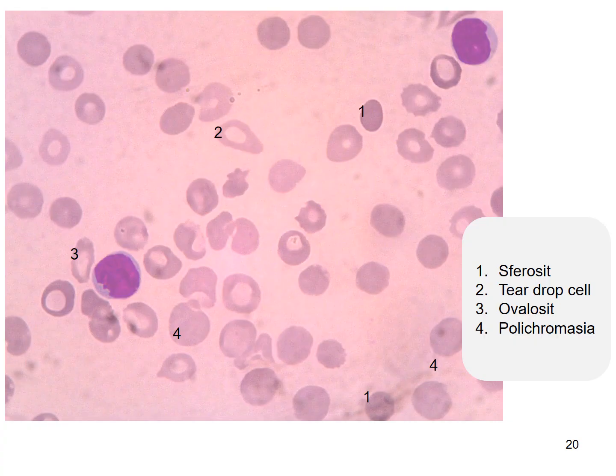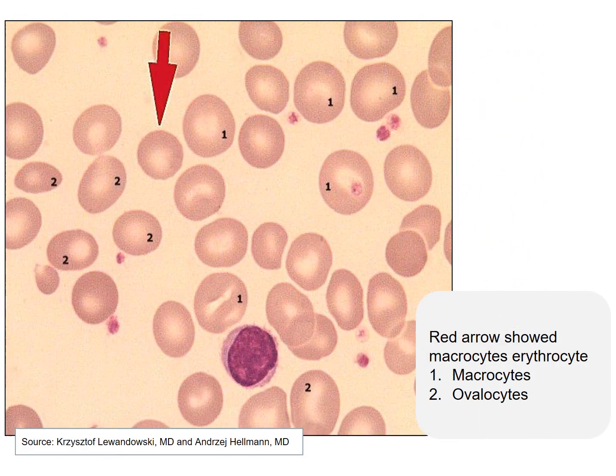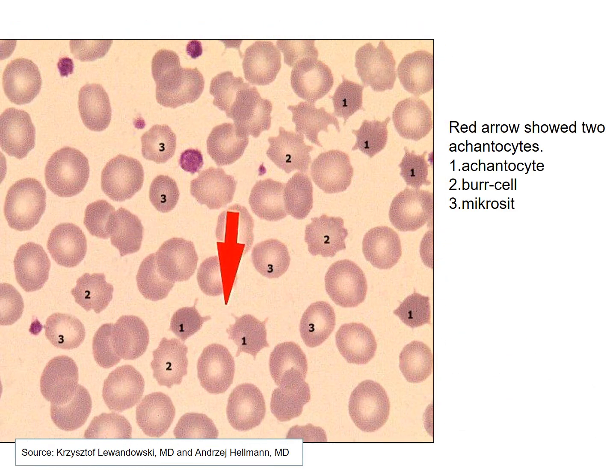Number one is a spherocyte, number two is a teardrop cell, number three is an ovalocyte, and number four is a polychromatic cell. This is a picture of ovalocytosis. In this next picture, we can see macrocytes and ovalocytes. Notice the acanthocytes, burr cells, and microcytes in this picture.